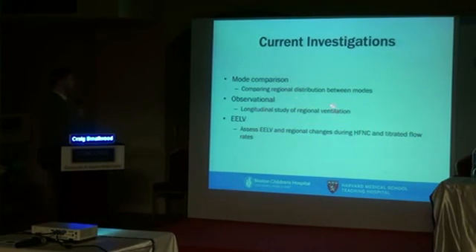We're also doing a longitudinal study of regional ventilation. So this is just more observational. We want to look at the time series or the evolution or progression of disease and then subsequent resolution. And we're also looking at end expiratory lung volume with high flow nasal cannula ourselves. And in this case, we're trying to not just say that we believe that high flow nasal cannula works. I think clinically you can't really argue with that. There's lots of good data in pediatrics and neonates to this point to support its utilization.